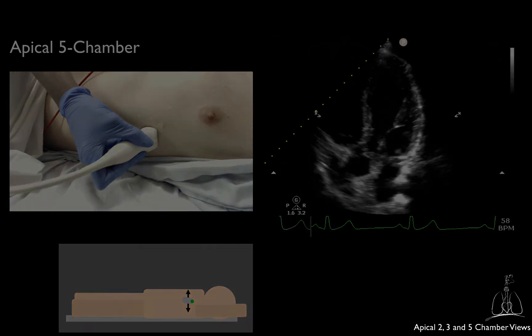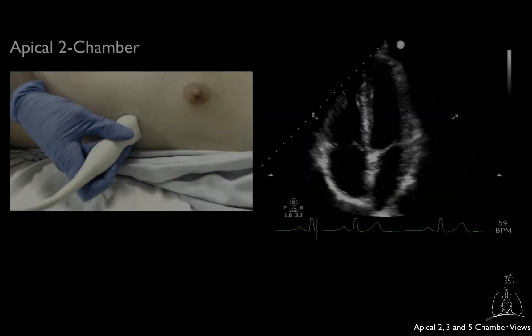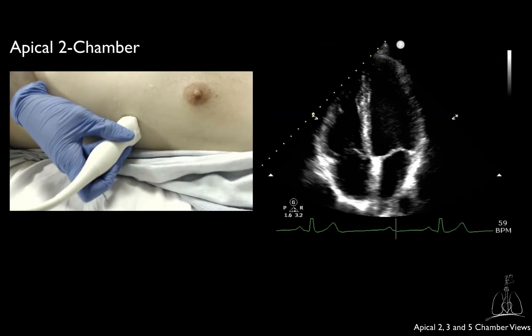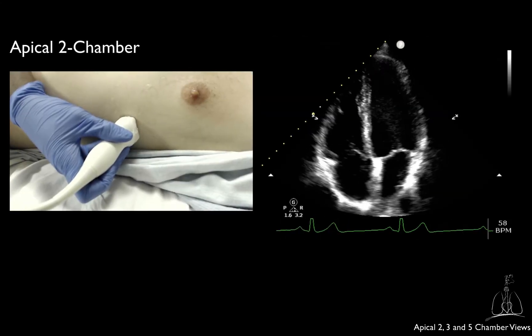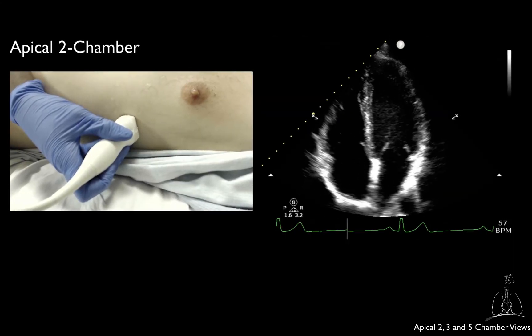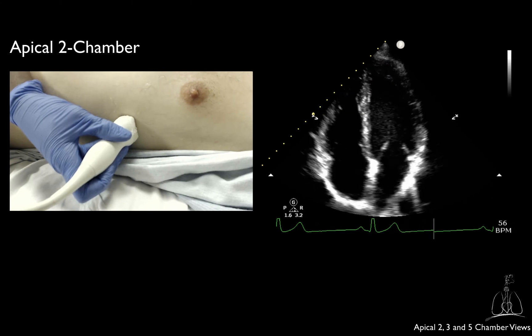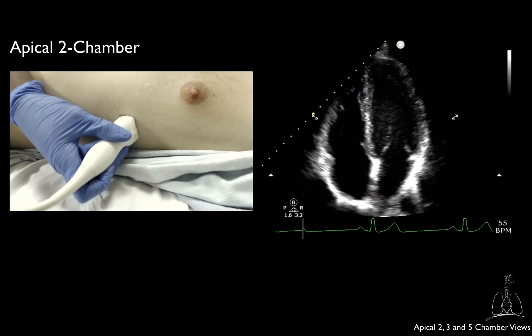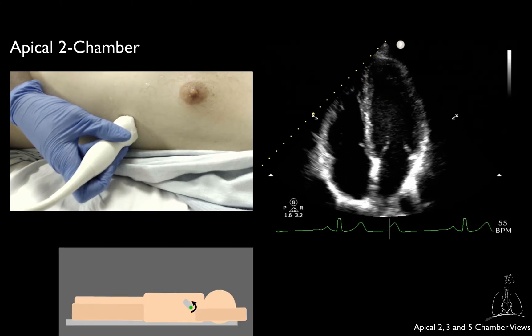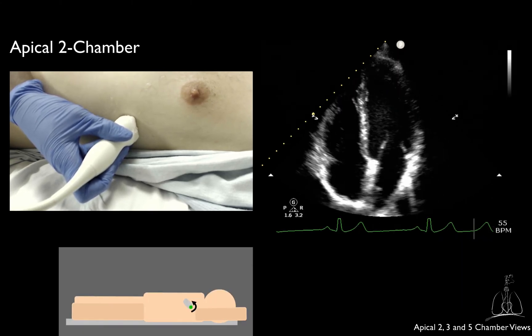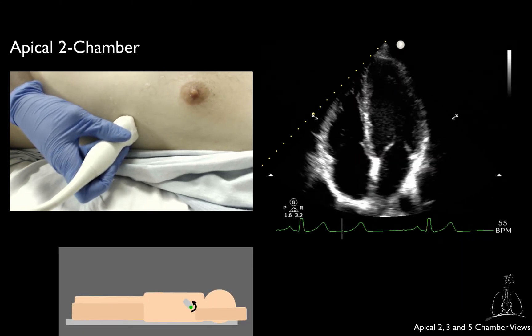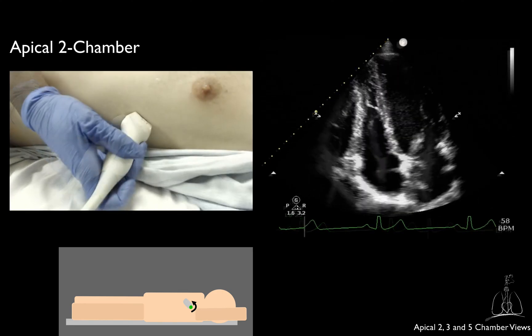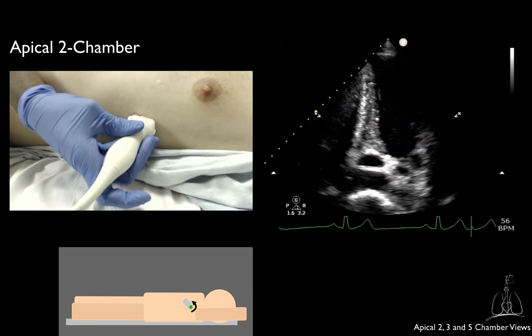To obtain the apical 2 chamber from the apical 4 chamber, make sure to keep the LV in the middle of the screen and then rotate between 30 and 60 degrees counterclockwise. You should not see any of the RV.